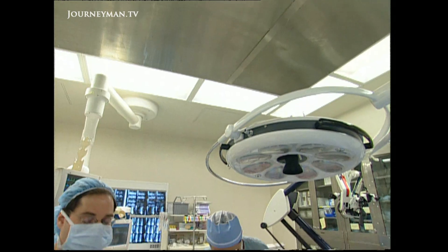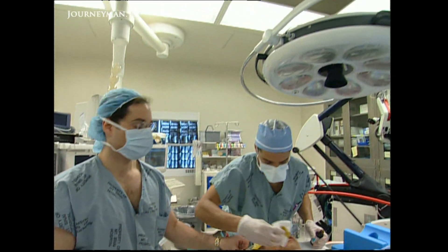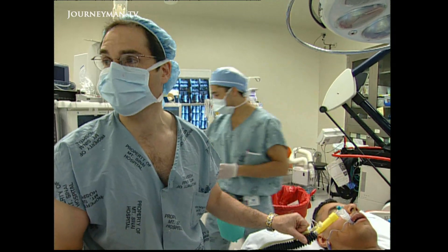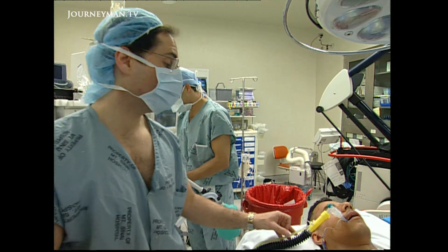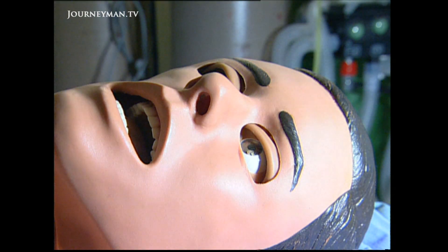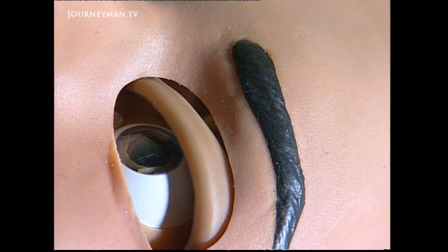Even though you know it's not a real patient, once you start getting into the actual simulation, that kind of goes to the back of your mind when you start getting into trouble, depending on whatever type of simulation you're running. Thankfully for this patient, everything was straightforward. But if it wasn't, Dr. Baez would handle the emergency with confidence, thanks to his skills as a doctor and with a little help from his friend.